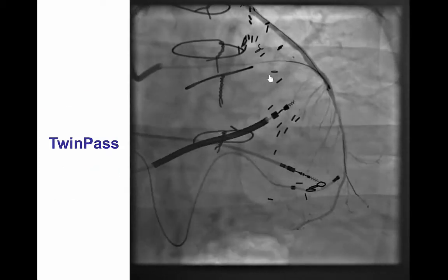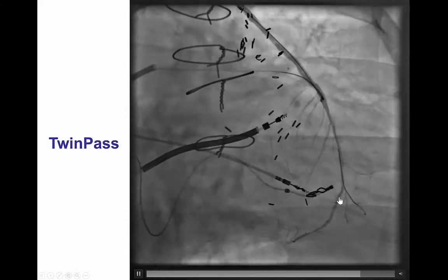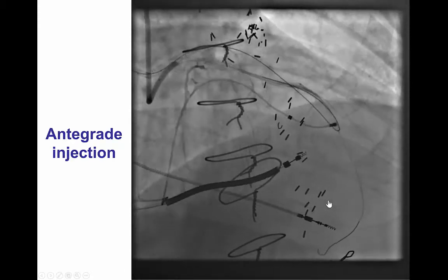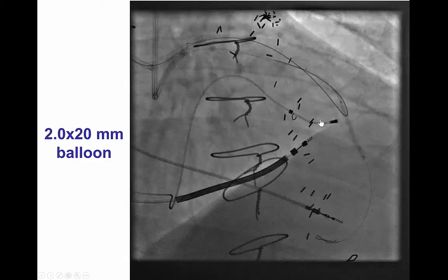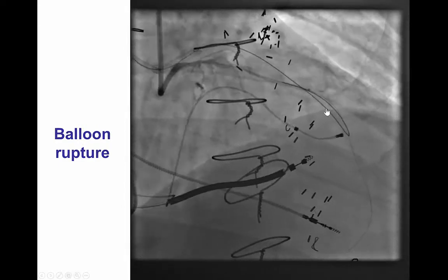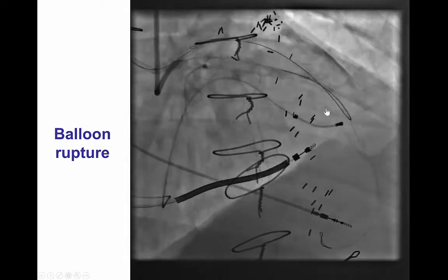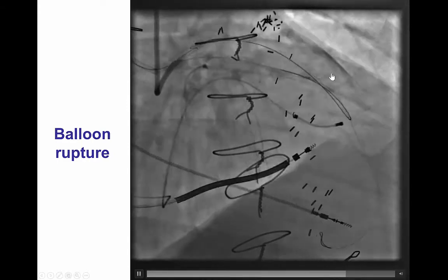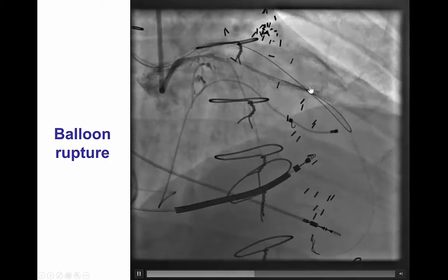In this case, we used a Twin-Pass microcatheter to advance a guidewire into the distal LAD. Antegrade injection after predilatation showed nice antegrade flow. We performed predilatation with a 2.0 by 20 mm balloon; however, the balloon ruptured more proximally. After the balloon was removed, we saw a large perforation of the mid-LAD with massive bleeding into the pericardium.